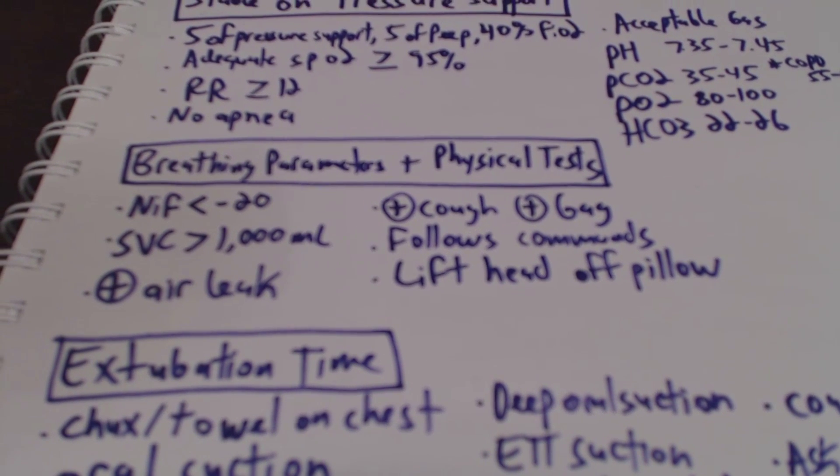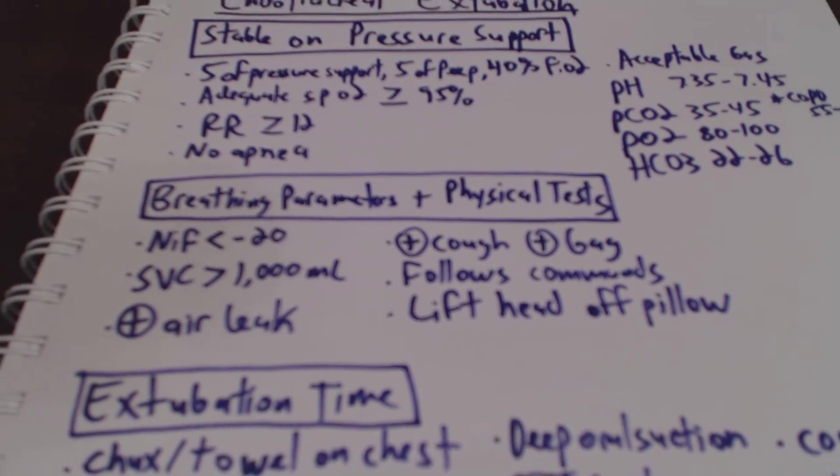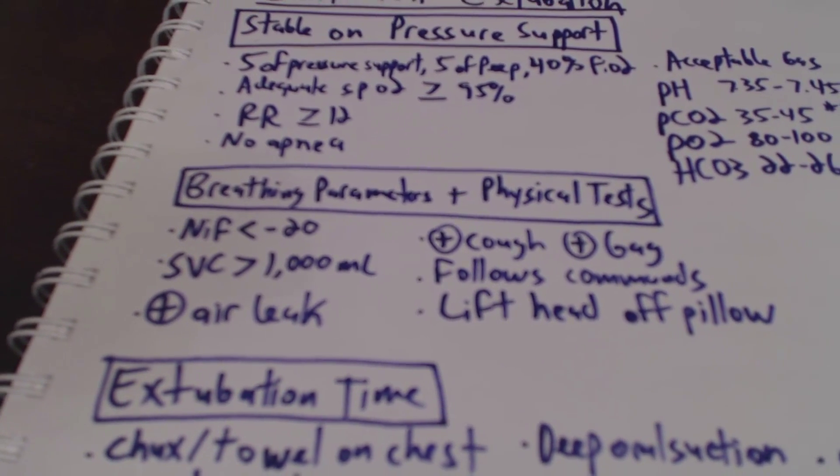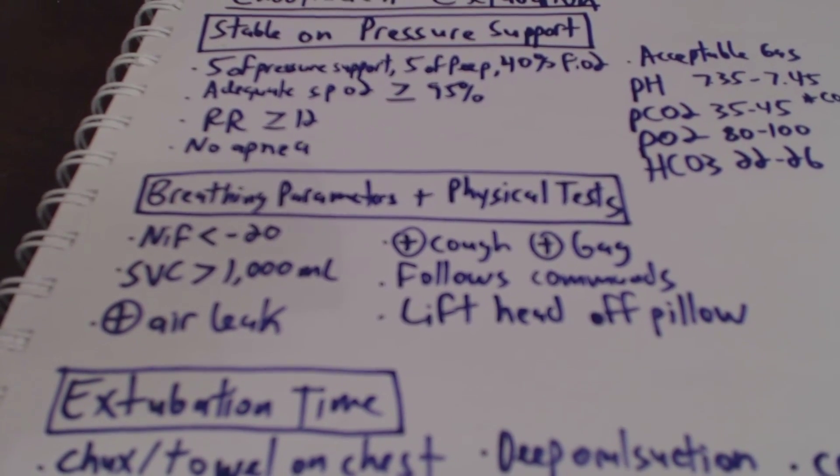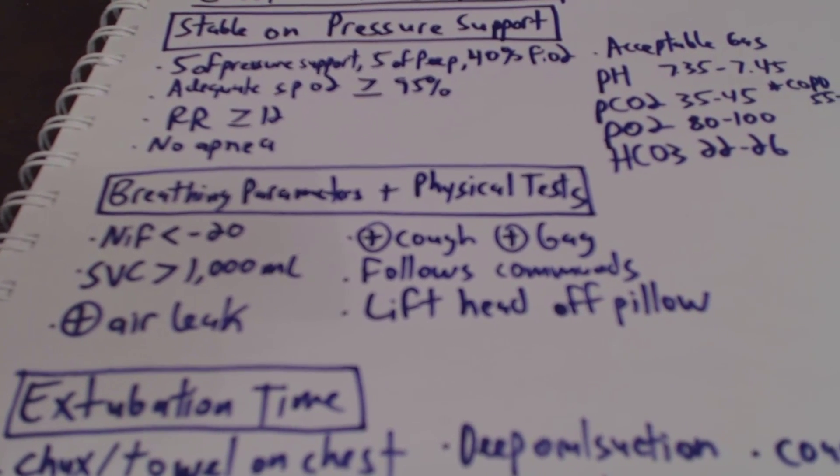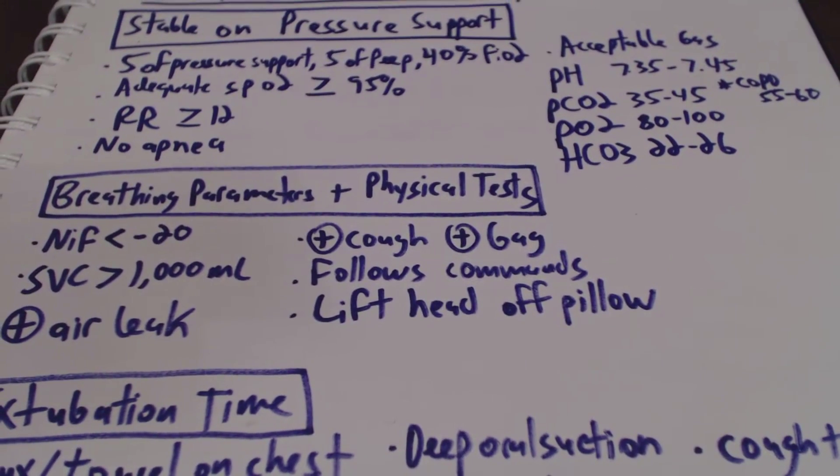Making sure there's a positive air leak is something that sometimes a respiratory therapist will forget, and it is our job to just do a light reminder for them to do it.